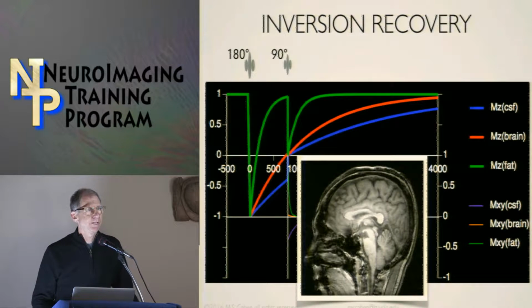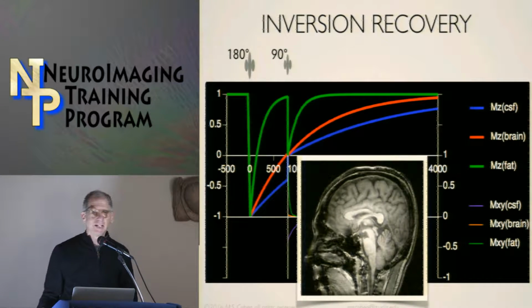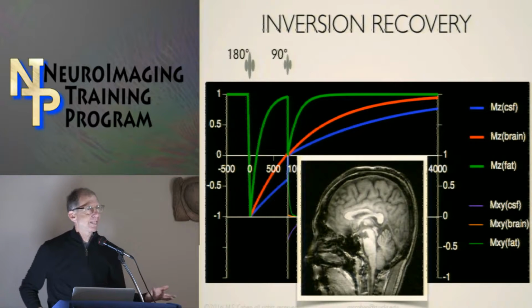How many people are doing either MP-RAGE or what's it called? SPGR. How many people are doing those? Yeah, good, 100%. So that's the basis on which these things work.